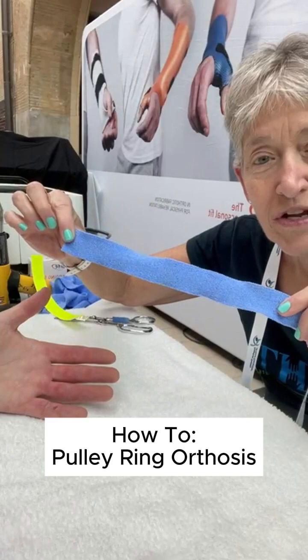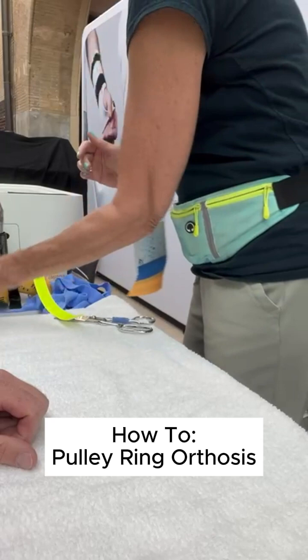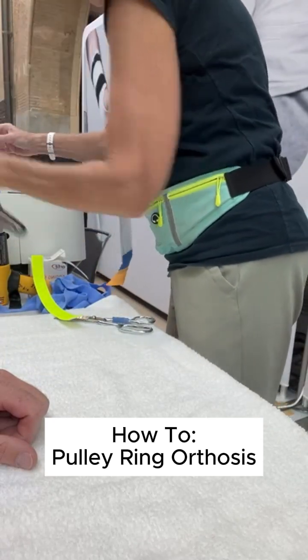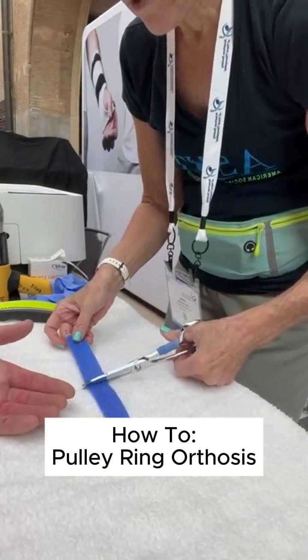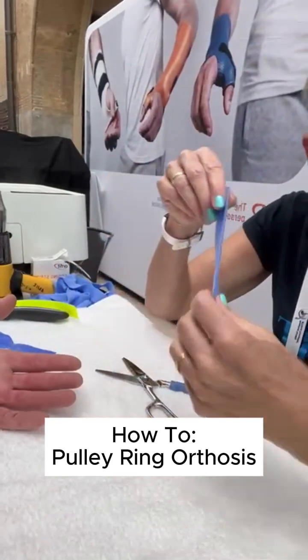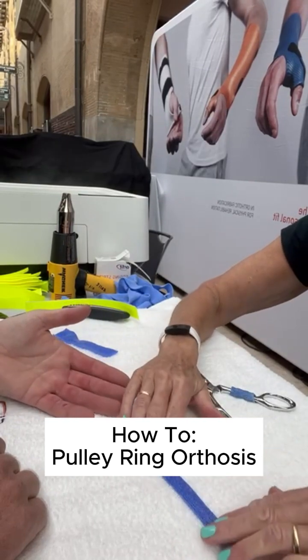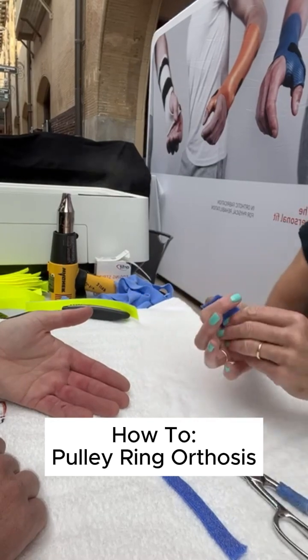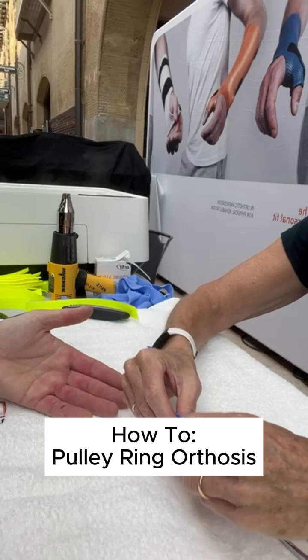We're going to take the Orphecast in its one inch width. It's a little bit hot. I'm just going to take the Orphecast and fold it in half to give it a little bit more stability. Something that the researchers said to do was to make it a little bit thicker in the front.